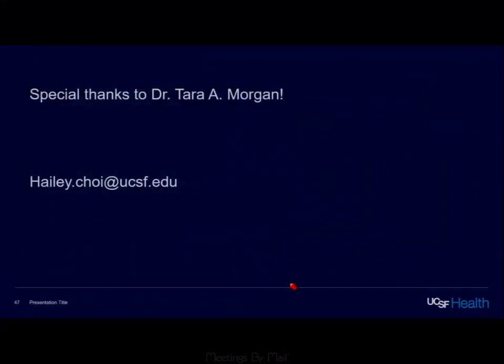So I think I highlighted some of the areas where ultrasound can be really helpful for clinical management and where the advantages are. And I think it's a good complement to the other imaging modalities we have.